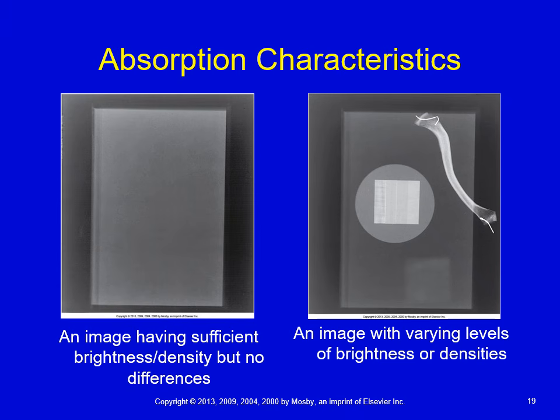It happened because each of those objects that was on the image receptor absorbed a different amount of X-ray energy. Some absorb more radiation, while others allow the X-ray photons to penetrate, exit, and be transmitted to that image receptor. So this goes back to that term differential absorption, and this goes back to why we see the different shades of gray on our X-ray images.